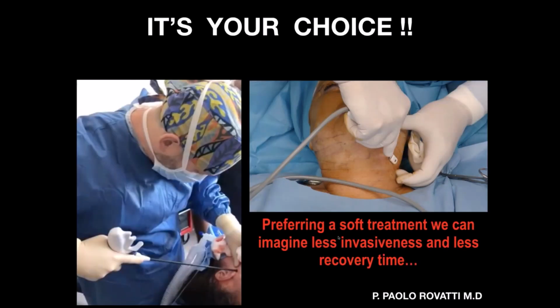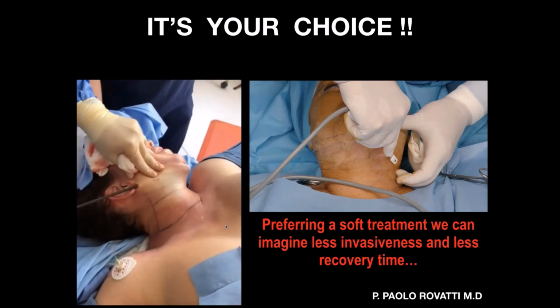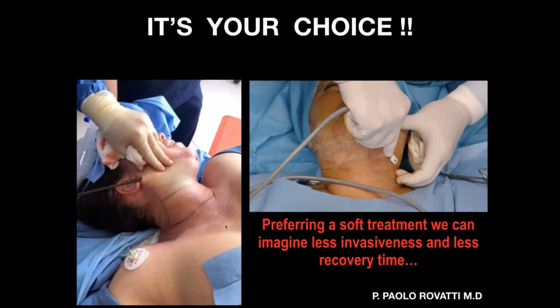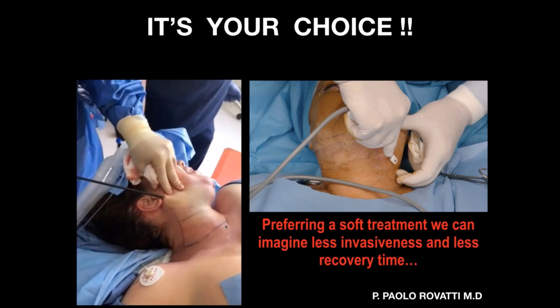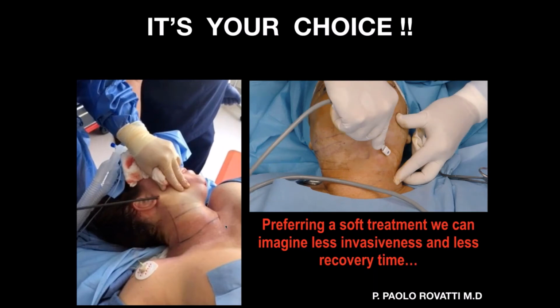Now, it's your choice. I want to show you that I've seen on YouTube some doctors, like this one, doing it with another device that is really, really invasive. Maybe he can do it, with many beautiful results, but I tell you, I prefer a soft treatment. I can imagine that my small cannula is less invasive, with maybe less downtime and less recovery time than a treatment with a really big device. So that's my suggestion, but it's your choice. I prefer to do less invasive.